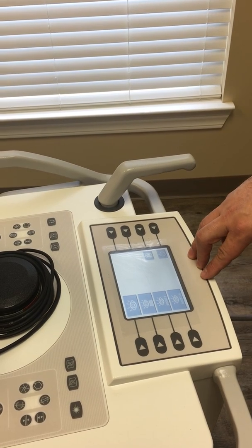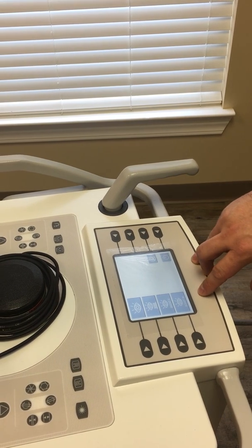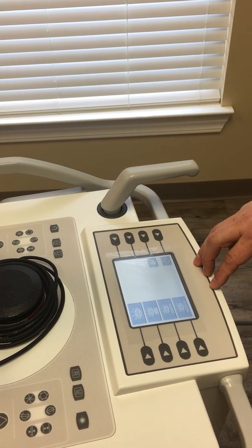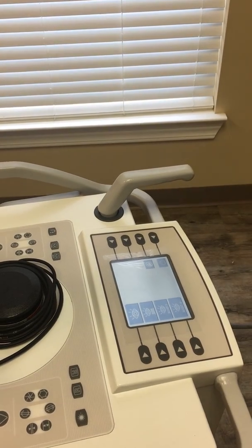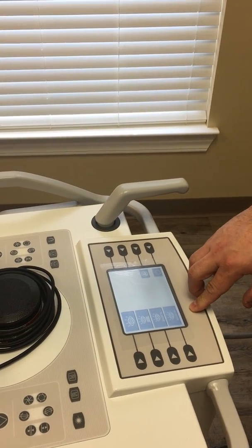Okay, so that's basically like, if you can't see something in normal fluoro, if you go to Boost 20 and shoot with that, it doesn't really matter how dense the patient is. You're going to get an image. If you don't get an image with that, then I don't know. Sorry, that's a healthy one, because it's a lot of dose, and you can push that through quite a bit of density.